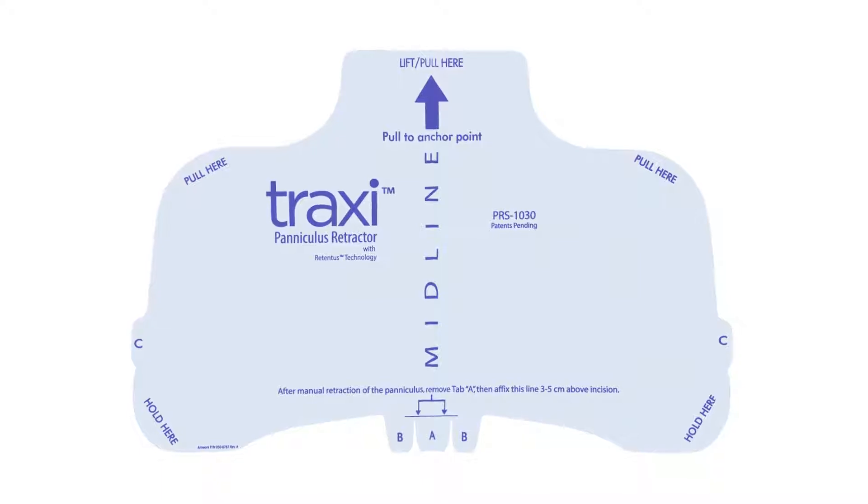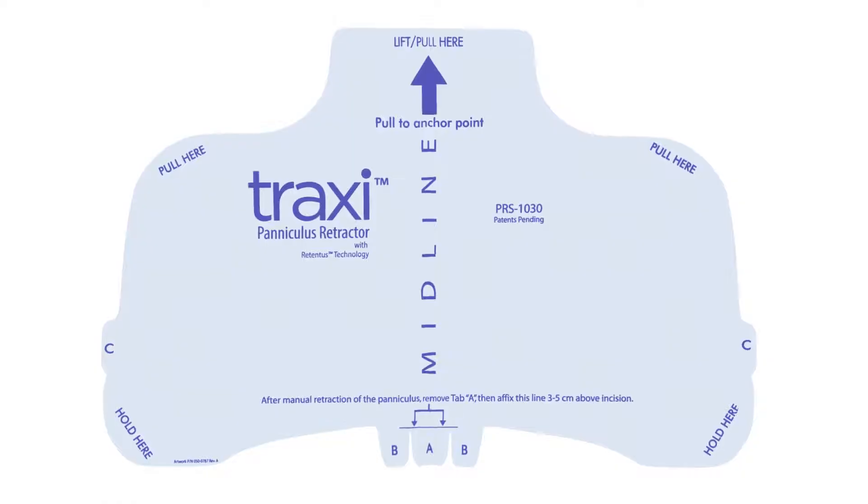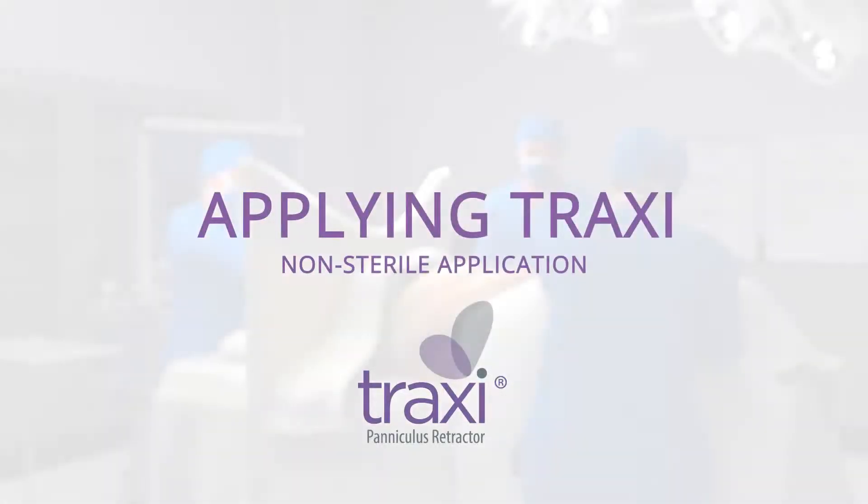Traxi is latex-free, supplied sterile, and can be applied aseptically or as a positioner prior to prepping the patient.